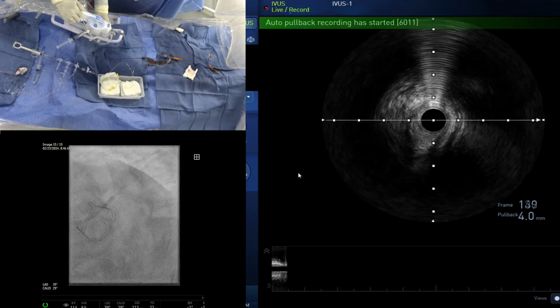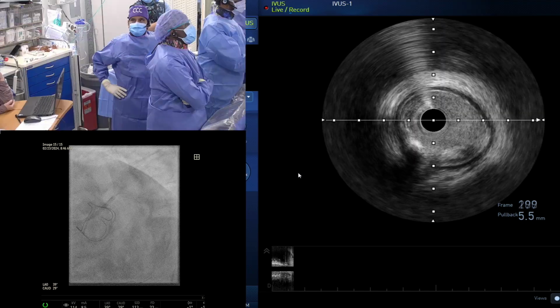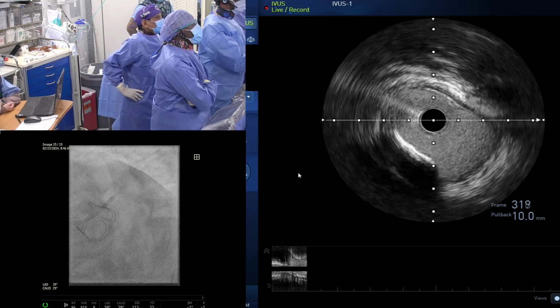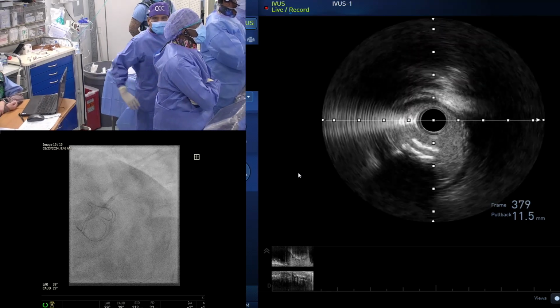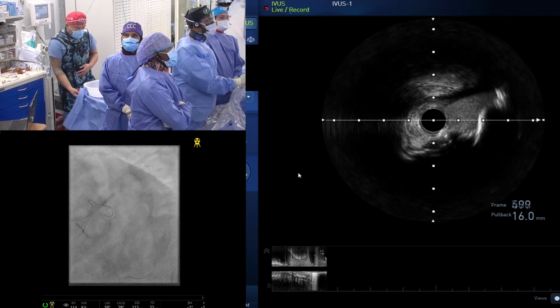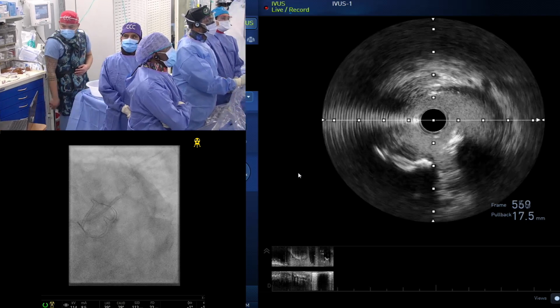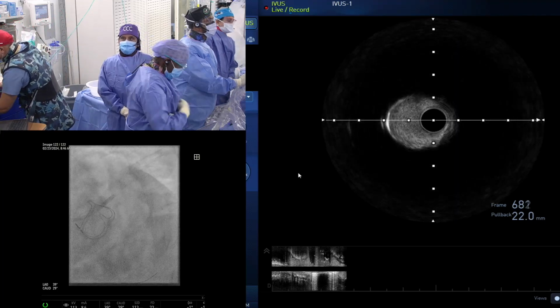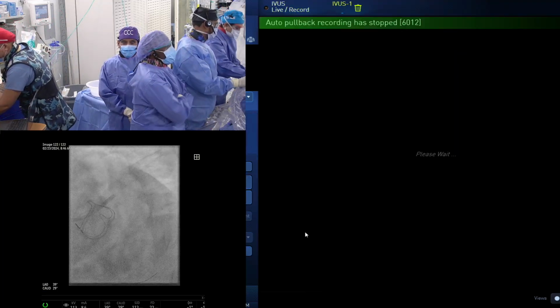Okay, now let's go to the IVUS. Very small, now coming bigger. This is a proximal circ. It's not that calcified, just one degree. Here's a nodule. This is distal left main. That's a nodule. So, a tight lesion, protruding inside. And I'll come to the proximal left main. The proximal left main is without disease.